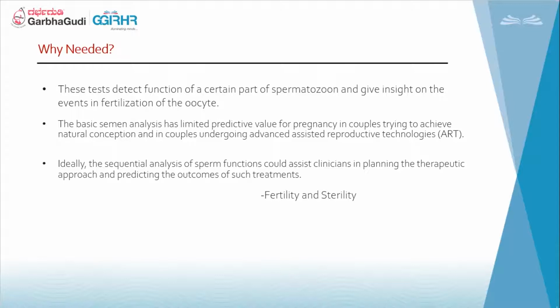So one question that may come is: isn't semen analysis enough? We do it on a routine basis in every lab. As soon as a couple enters a fertility clinic, we prescribe some basic tests, and in the basic tests for the male, the semen analysis comes. So why leave out semen analysis, and why is it not enough?